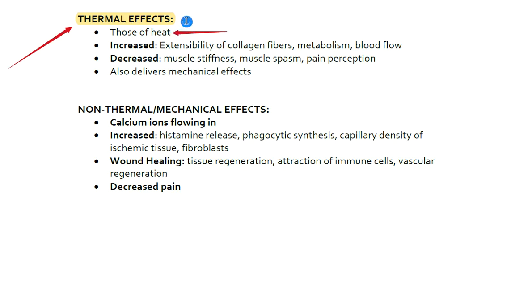With that, if the intensity of the waveforms is at a significant level, it can cause significant vibration, and that will cause heat. It will cause these effects of extensibility of collagen fibers, just like a hot pack would. It would cause an increased metabolism and an increased blood flow. In terms of what is a decrease, it may decrease the muscle stiffness. It may decrease the amount of spasm or tension in the muscle, and it may also feel good. So it may decrease the pain.